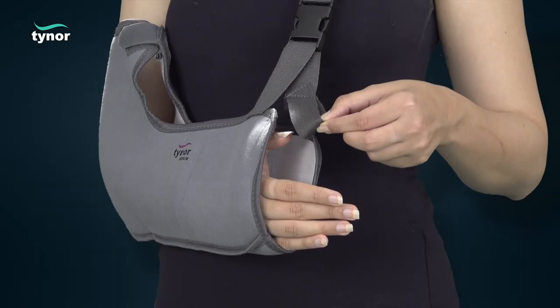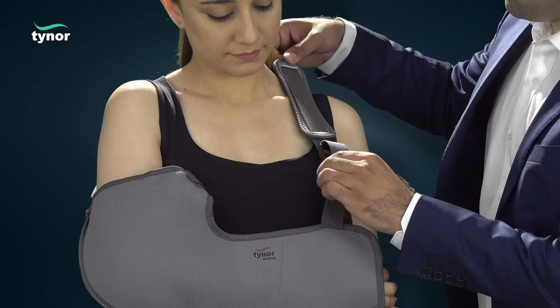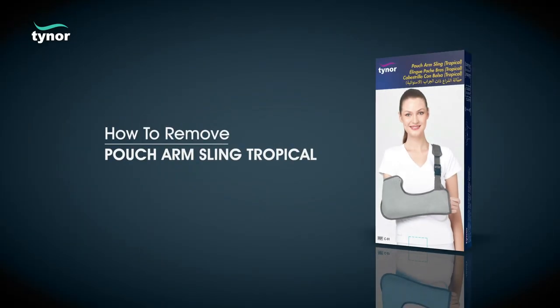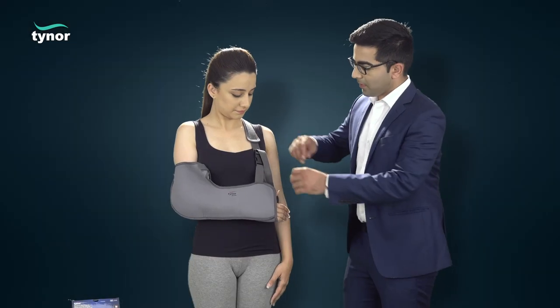Put the thumb in the thumb cradle provided to relieve the thumb muscles. Position the shoulder pad at the point of load bearing for comfort. Now let us see how to remove the pouch arm sling tropical.